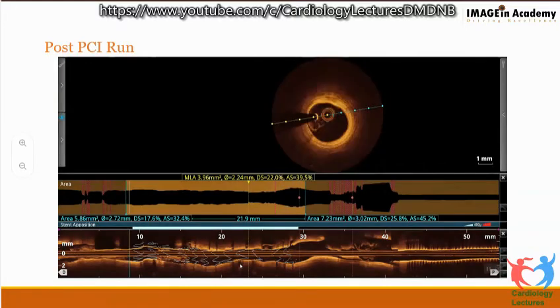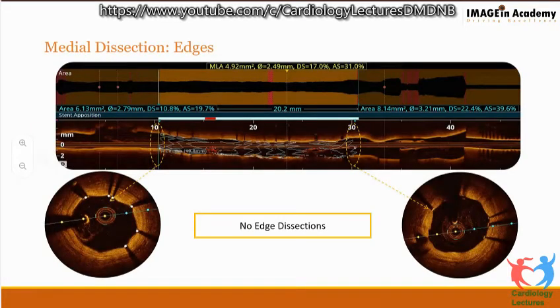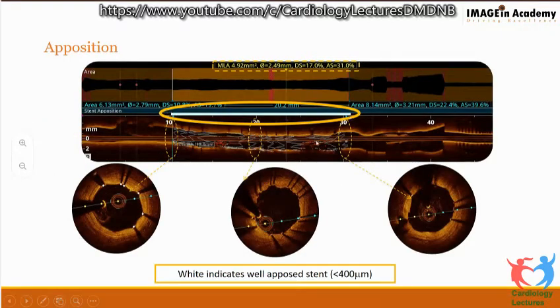As you come towards the proximal segment, again, the vessel appears well expanded. So we check for dissection. There is no edge dissection. We look for apposition. Everything is white. That means the stent is very well apposed. A well apposed stent need not be well expanded. So there are two different things, apposition and expansion. This is a very well apposed stent because the line is absolutely white. So white indicates stent apposition is fine.